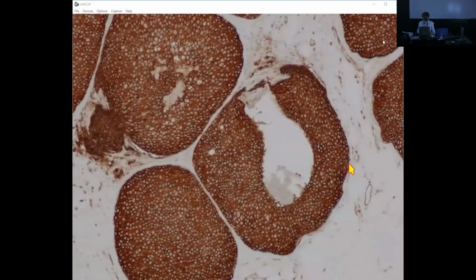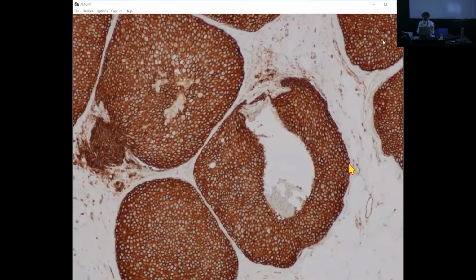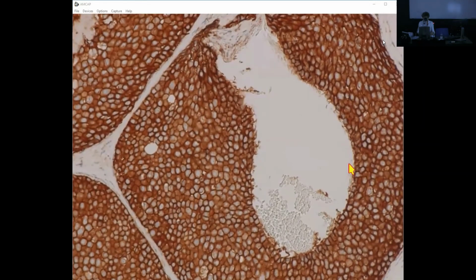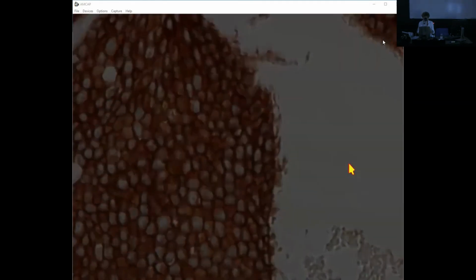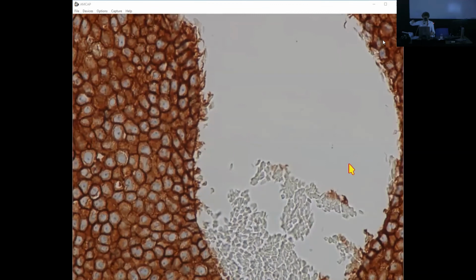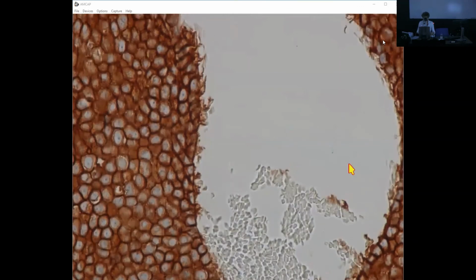Now, is this a truly mixed ductal and lobular carcinoma? Definitely looks like some of the cells are polarized, and E-cadherin, actually P120, has this U-shaped staining, not staining the membrane on the side facing the lumen, which is the appropriate staining pattern.